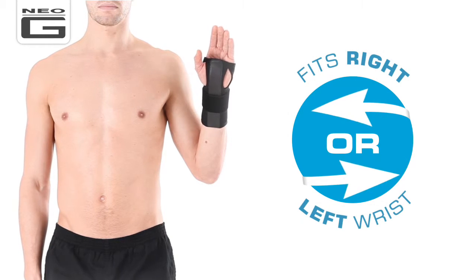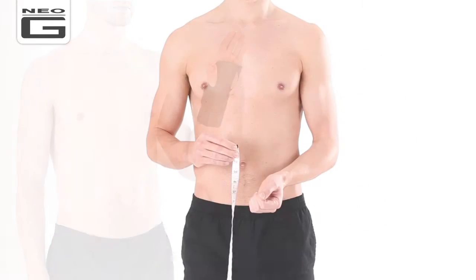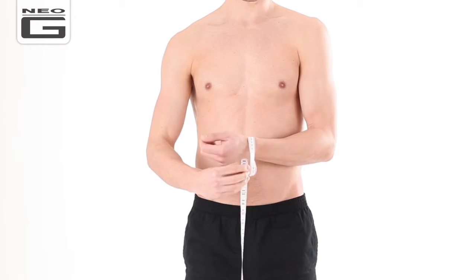This Neo-G EasyFit Wrist Brace has an innovative design which fits the left or right wrist. To ensure the right fit, measure the circumference of your wrist, as this product comes in three sizes: small, medium, and large.